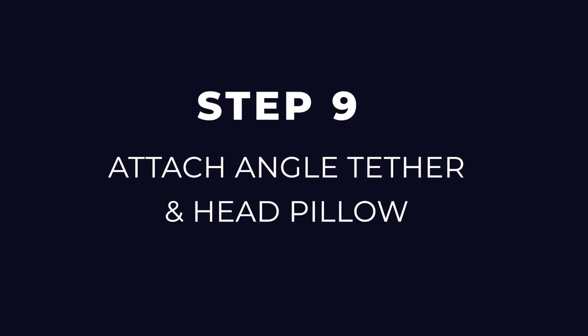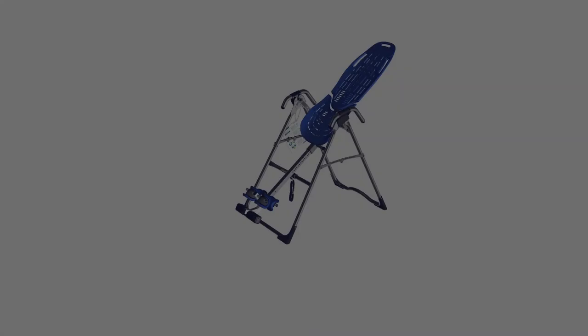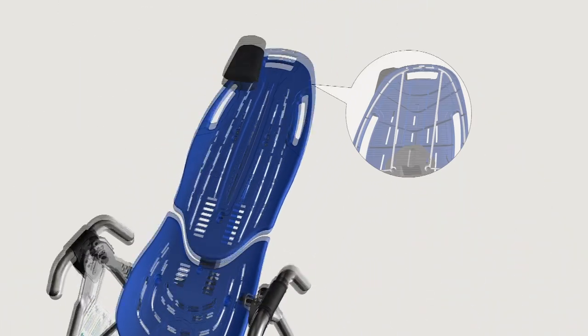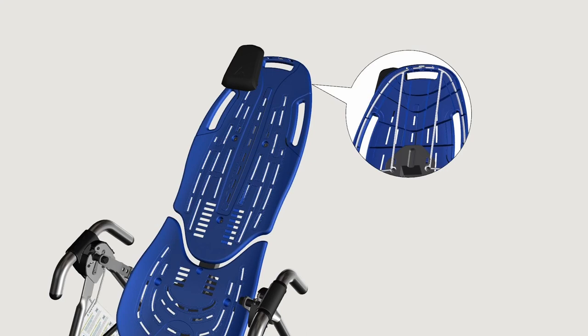Step nine: attach angle tether and head pillow. The tether will come preassembled to the A-frame. Unfold the adjustable tether and clip it to the U-bar on the underside of the table bed. Slide the buckle to lengthen or shorten the strap depending on your desired maximum angle of inversion. To attach the head pillow, locate the slots at the top of the table bed just beneath the handhold. Insert the two pointed ends on the back of the head pillow into the slot of the table bed and pull through from the back to secure the pillow into position.